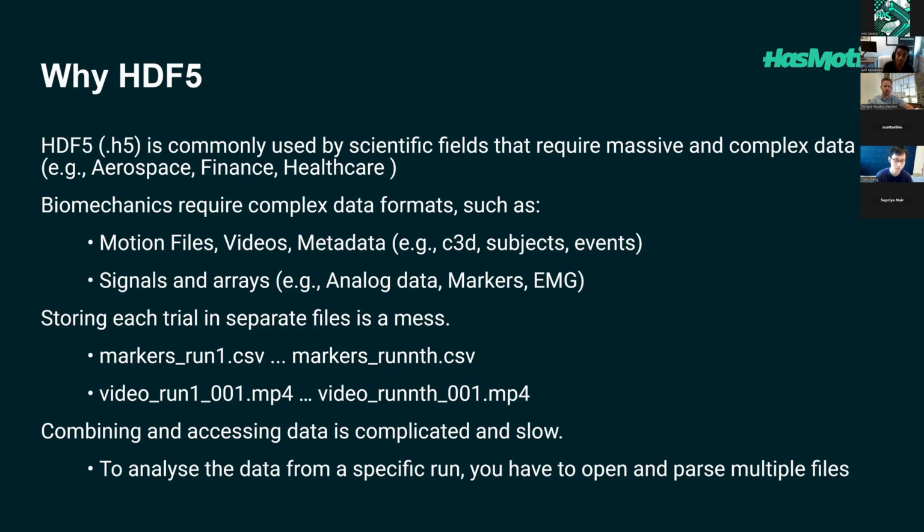For example, you might have huge signals with different data types that you have to parse and read. So for organizing this kind of bookkeeping for each trial, you can, for example, have a single file or a single group for each trial, or you can store each modality, such as force data, analog data, and markers, separately.